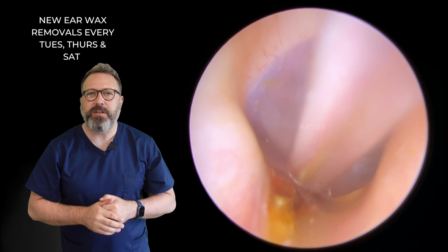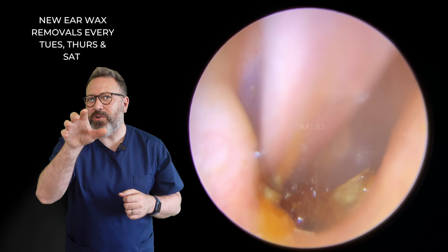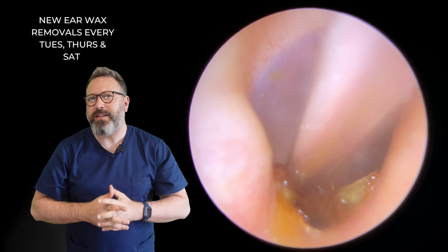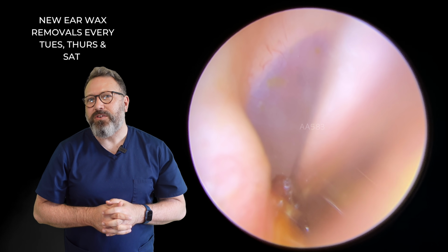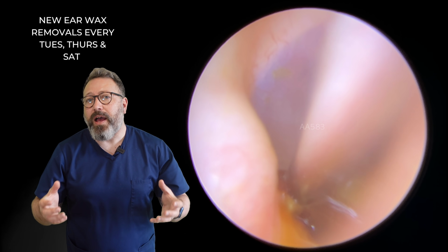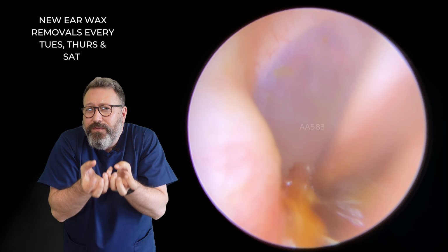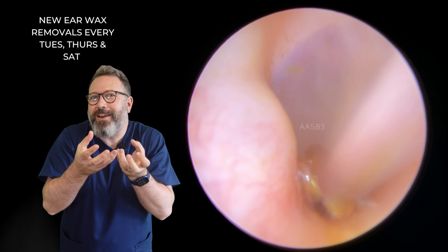So what I've done here is popped a little bit of olive oil in. It's not an easy one to get out because you can see we've got this little bump here to the left hand side. So we've got this slight narrowing to the canal just in front of the eardrum. But as you can see, as I'm trying to lift this, you'll see the olive oil's just made that a little bit fuzzy there on the one side. But as I'm trying to lift this, you'll see that whole section of skin just lifting out of that bottom portion of the ear canal. But it still wants to hold on there really tightly.